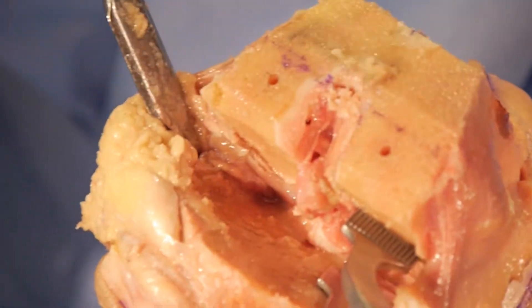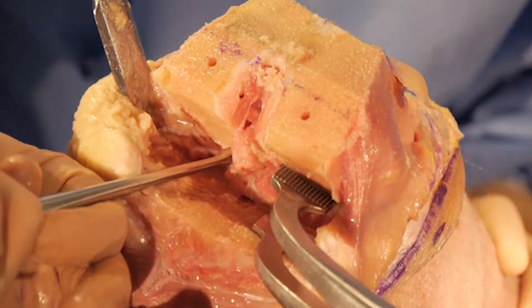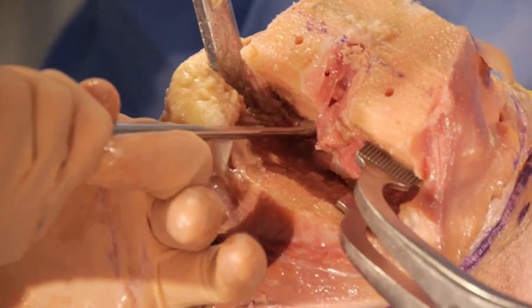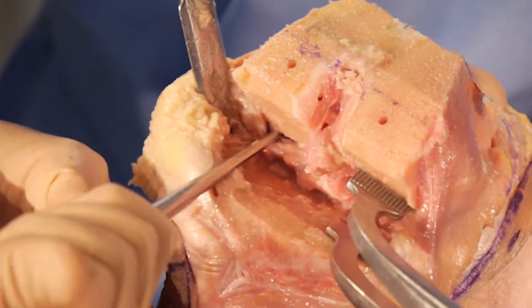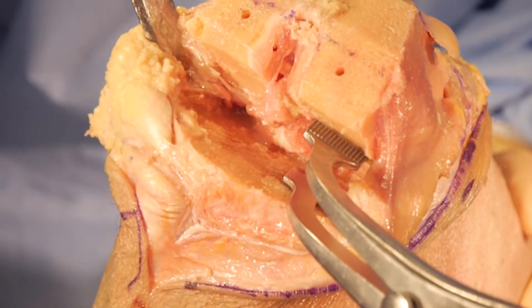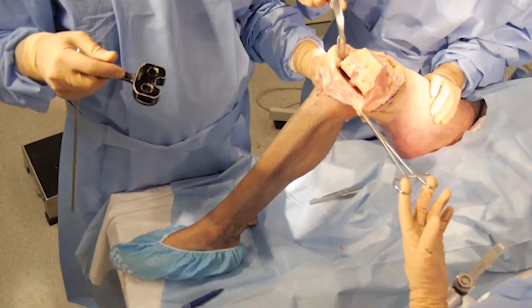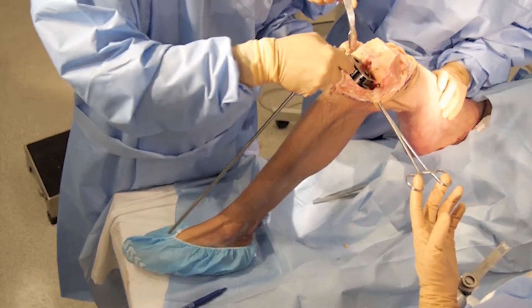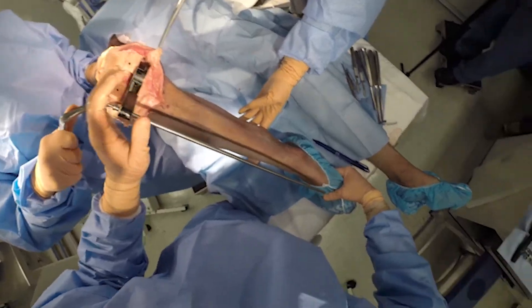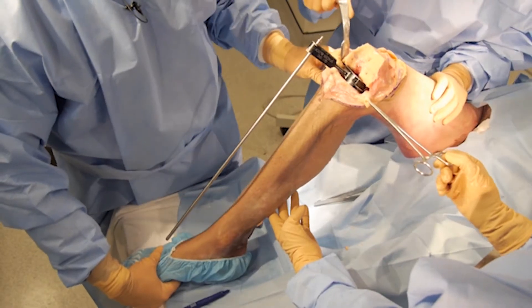At this point I check for osteophytes, and using a curved osteotome and/or curette you can remove posterior osteophytes to make the back of the knee nice and smooth. Now I've completed my femur cuts. I'll check my flexion gap to confirm I like my flexion space and overall alignment — removing the spreaders, inserting my 9mm spacer block at 90 degrees of flexion. The drop rod should go right down the tibial shaft along the second metatarsal, which it does very nicely.